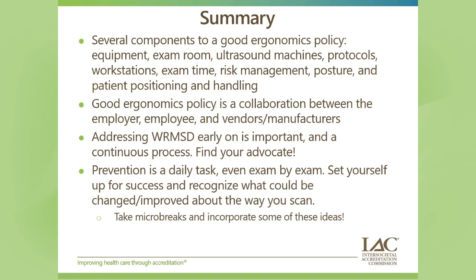So looking at our equipment, the exam room itself, how is it set up? What is the lighting like? What kind of things do I have in here that are ergonomically friendly? What is my ultrasound machine giving me? Is it compatible for most of my users? What's our protocol like? Where are we meeting our standards? And what additional tools do we have that can keep our protocols efficient?